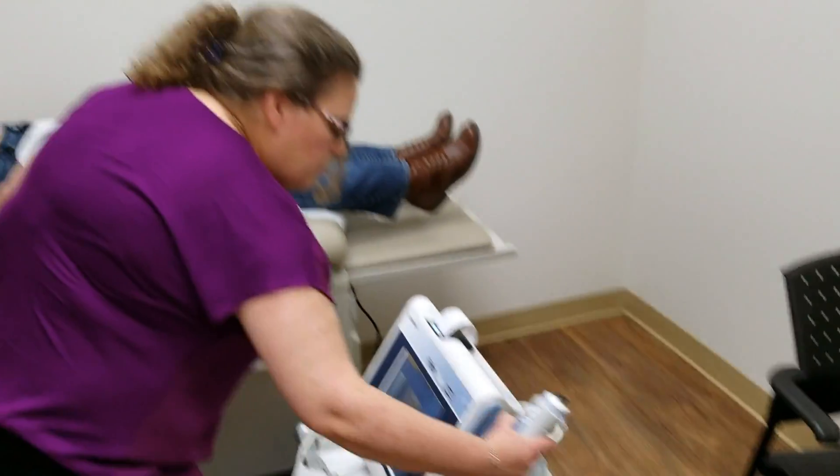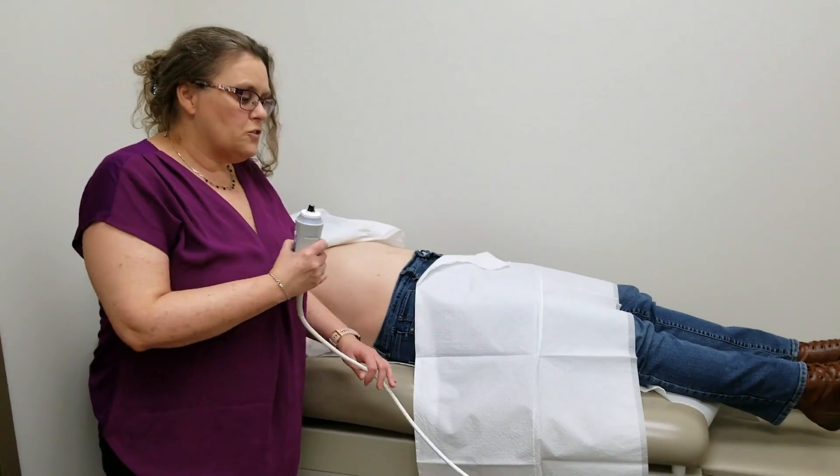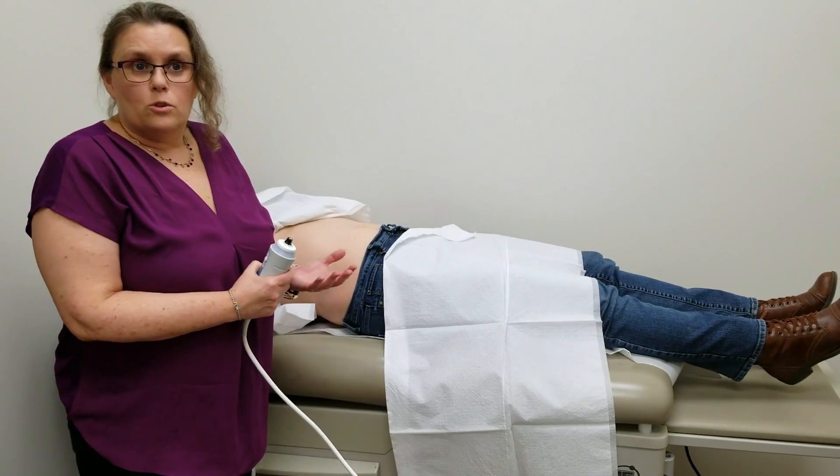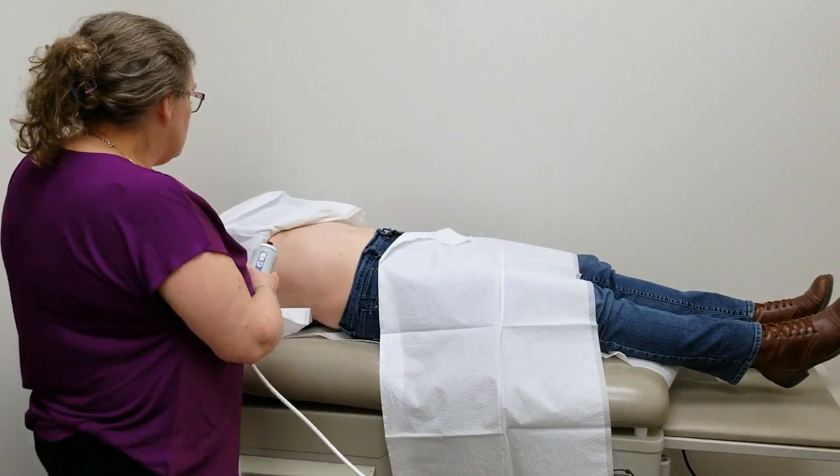I will take my probe, which I've already put the gel on. The worst part of this test for most patients is actually the cold gel. It's like an ultrasound in that way, where we put gel on to conduct the elastic waves.